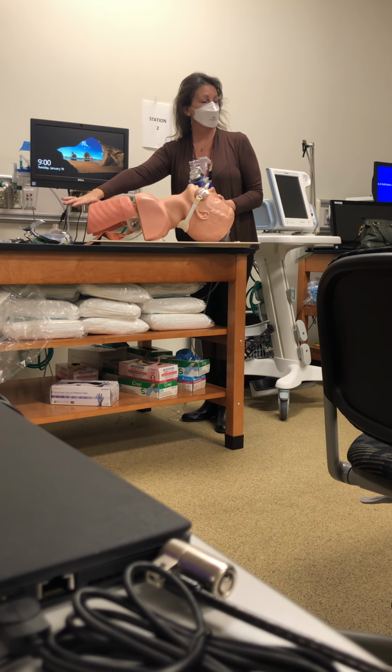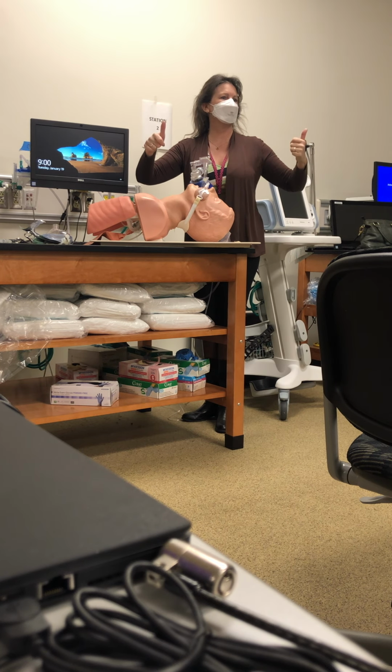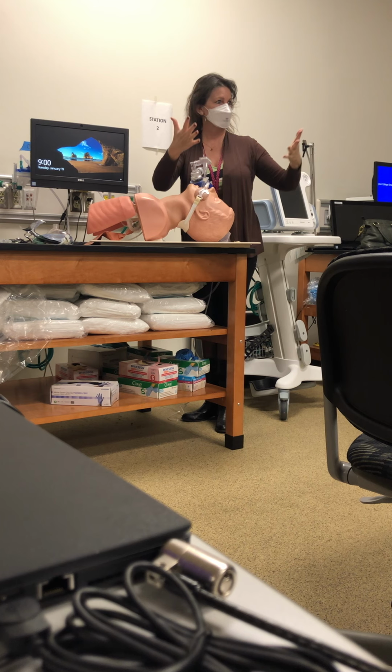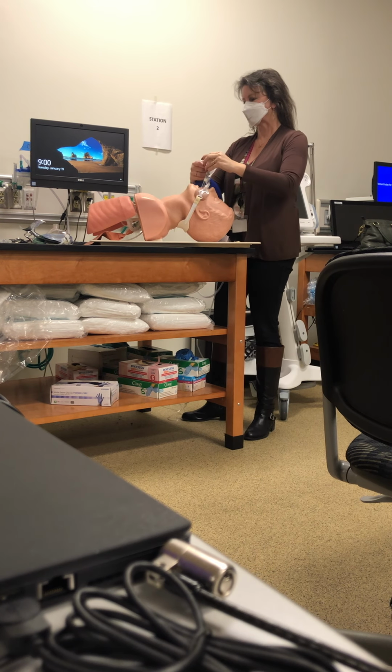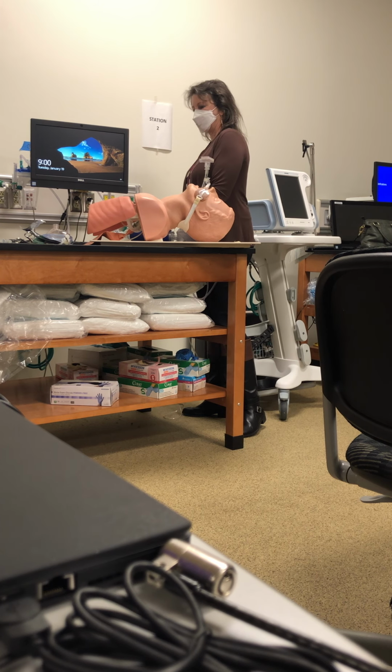No gastric breath sounds, but I hear breath sounds in the right lung and left lung. We have clear bilateral equal breath sounds. That's what you're going to say, okay? So we've intubated, we've got bilateral breath sounds. We are good.